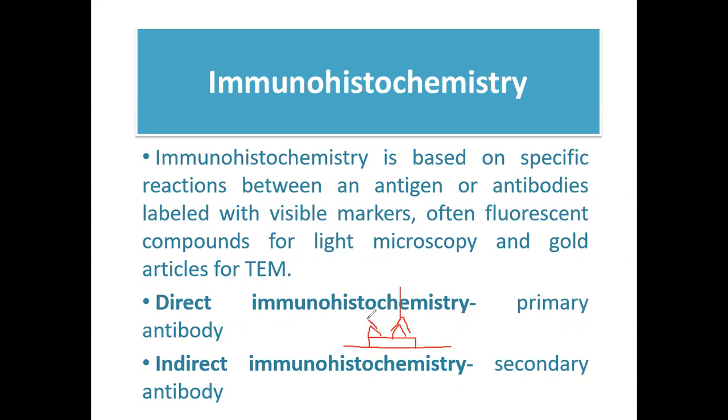So for example, primary antibody. Dahil dadalawa lang yan, kunwari meron pa tayong isang primary dyan. O, yung mga unbound, ito unbound siya, wala na siyang pagkakapitan na antigen. Pag nag-rinse tayo or nag-wash tayo guys, itong antibody na ito mawawash out. Okay? Mawawash out siya. So tatanggalin natin siya kasi nag-wash tayo. Okay? So ang matitira lang yung mga nakabind dun sa antigen natin. Kung dalawa yan, may dalawa din tayo nung antibody.